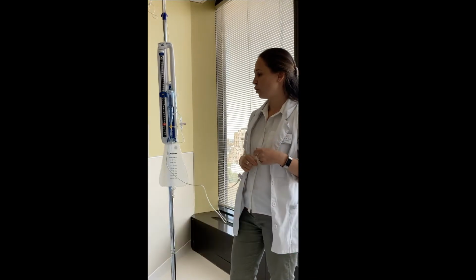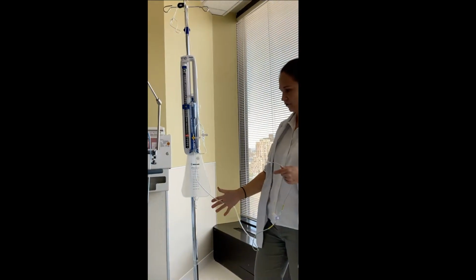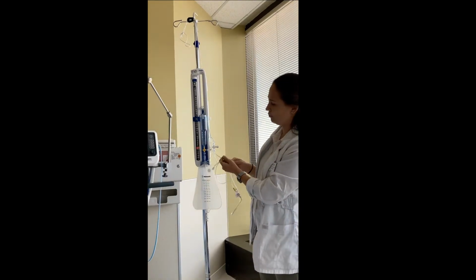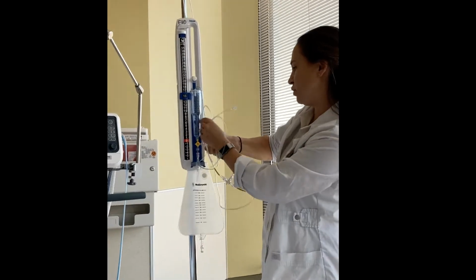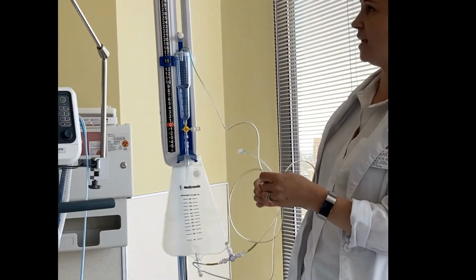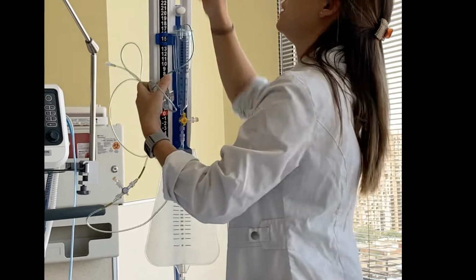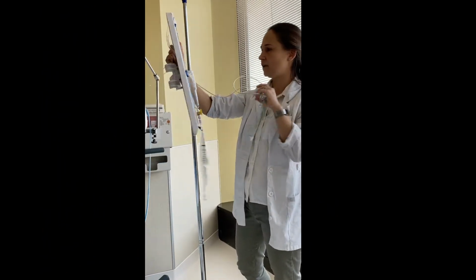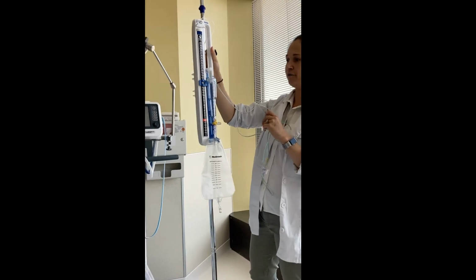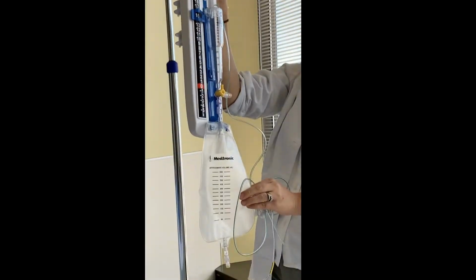Let's look at the components of the system. This is the external ventricular drain. It will come assembled like this. I'm just going to show you some of the components of the system. So when you take it out of the box, this is what you will see. Here you have a burette or a drip chamber, and you also have a collection bag.